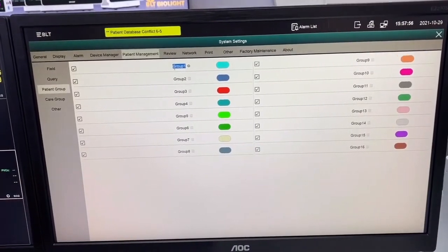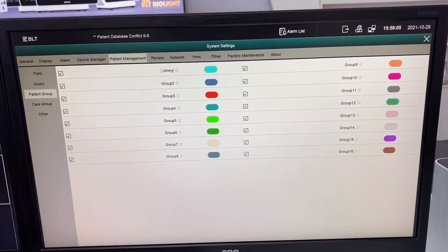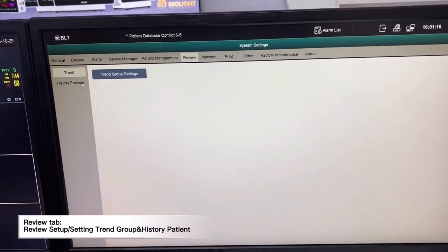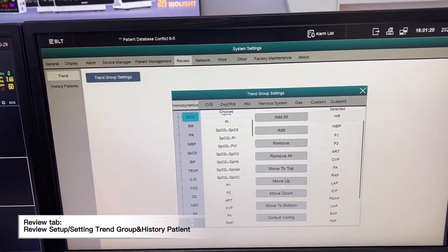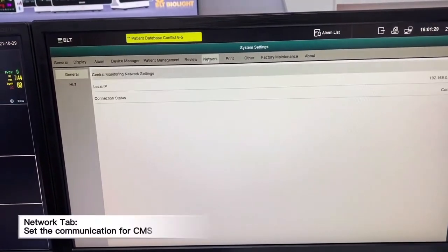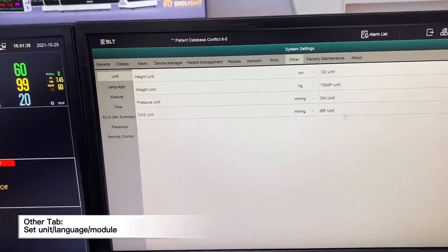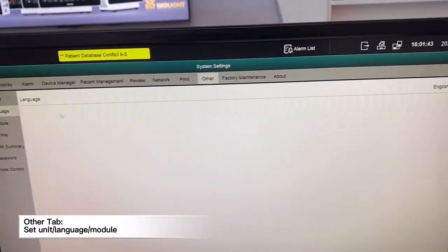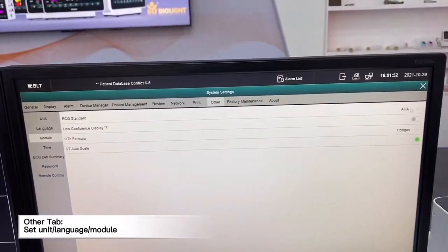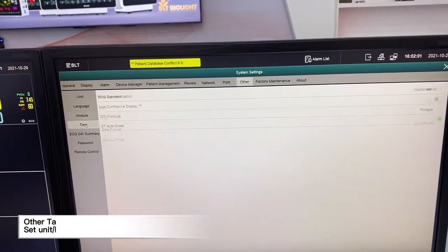We can change the group name. We have a review page where we can set up the review settings. We can start the network, set up the printer, and change the language in the settings. We can also customize modules — the first one is ECG standard, and depending on which ECG standard we use, either AHA or IEC, you can also change the system time.